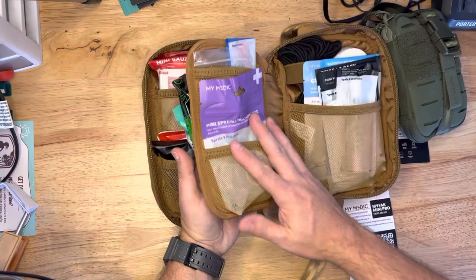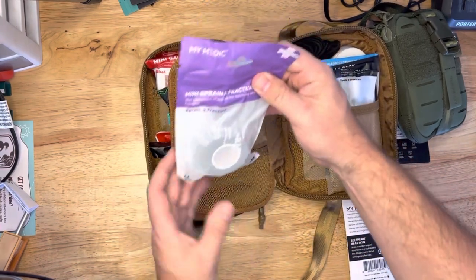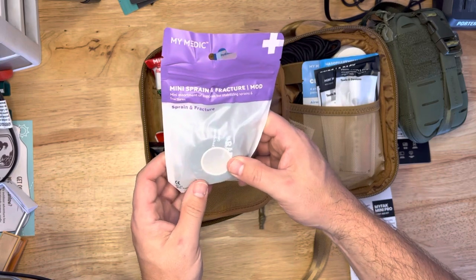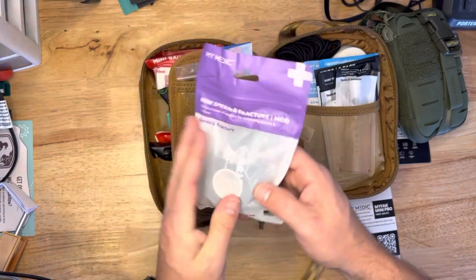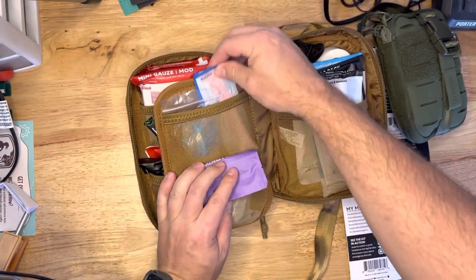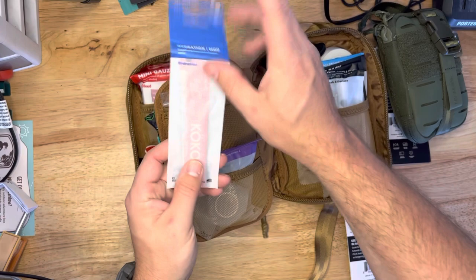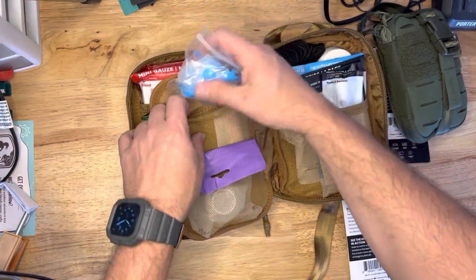On this side, you've got this little divider that folds in half, which is nice. We've got a sprain and fracture mod — so a finger splint and a self-adhesive roll there, in case you break your finger or dislocate it or something. Some hydration. And a face shield — yep, CPR shield.